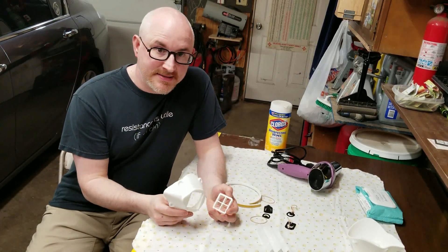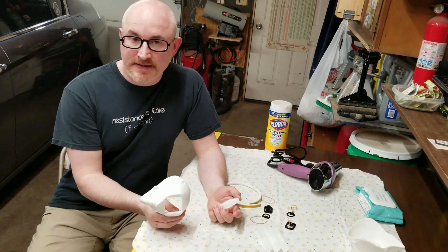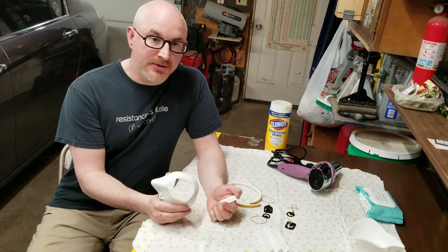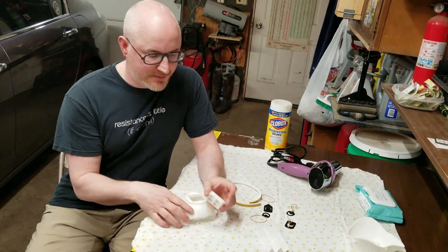If you have one of these masks or received one of these masks, this is what I call the Montana mask, invented by a doctor in Montana. It's www.makethemasks.com. The idea here is pretty simple.